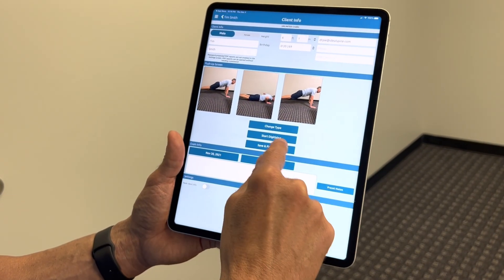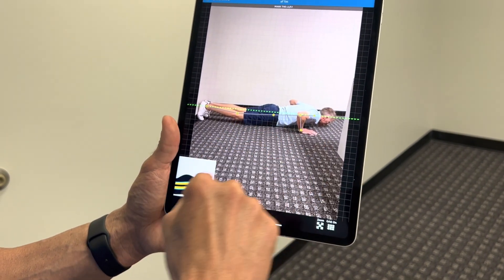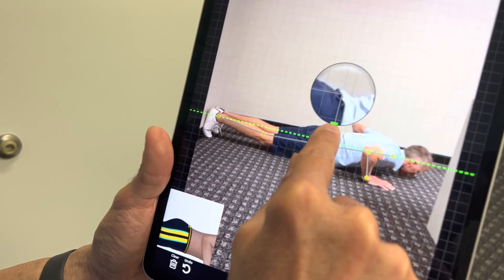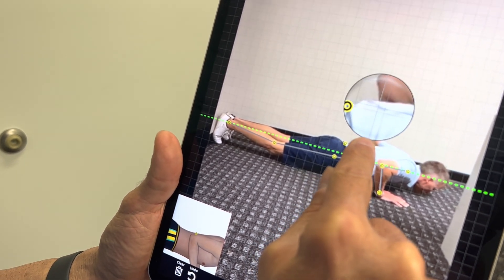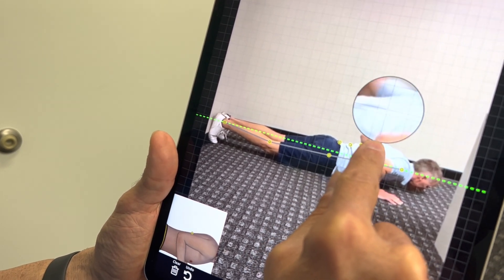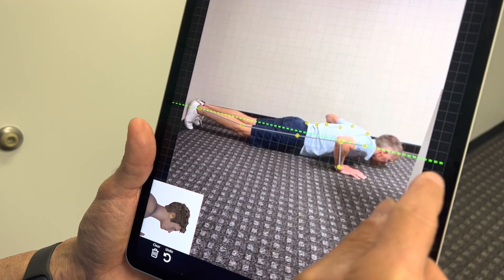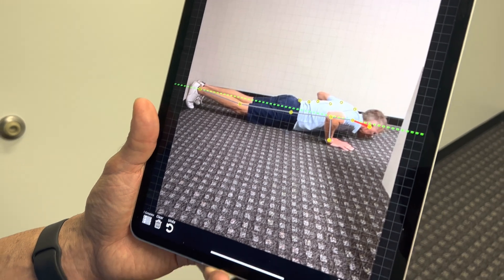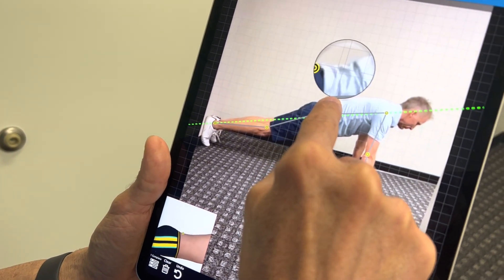You can save and finish later, or hit start digitization. Now we're going to digitize the lumbar region. It's best if the person is in revealing clothing — he's not, but we'll do our best. The bottom left corner tells you where you're digitizing as you go.